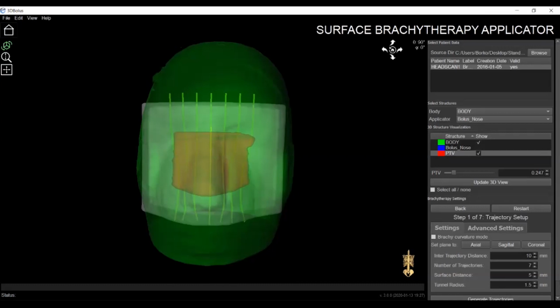I must say that this feature and most of the features are coming through our cooperation with our clinical users and clinical partners, and I'm really satisfied with this cooperation, where any kind of clinically beneficial settings and features can be implemented in future installments of the 3D bolus, just by making this clinical collaboration.